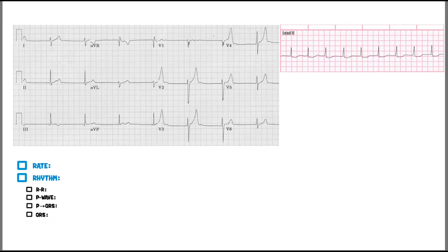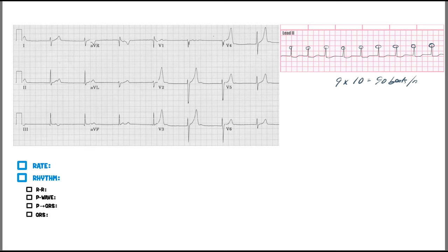All right, so now let's take this next EKG. For rate, we don't have a rhythm strip here, but we would add all the R waves up and multiply by six. On this one, with a six-second strip we multiply by ten: one, two, three, four, five, six, seven, eight, nine — that'd be nine times ten, 90 beats per minute.